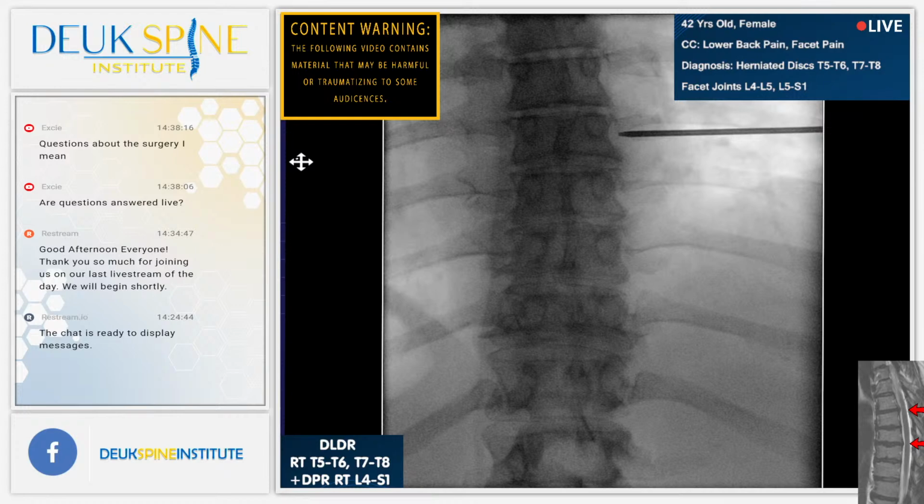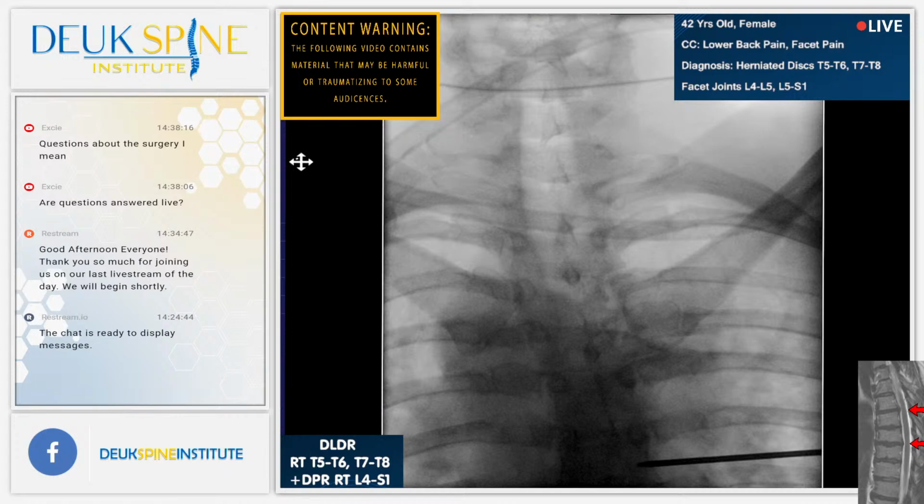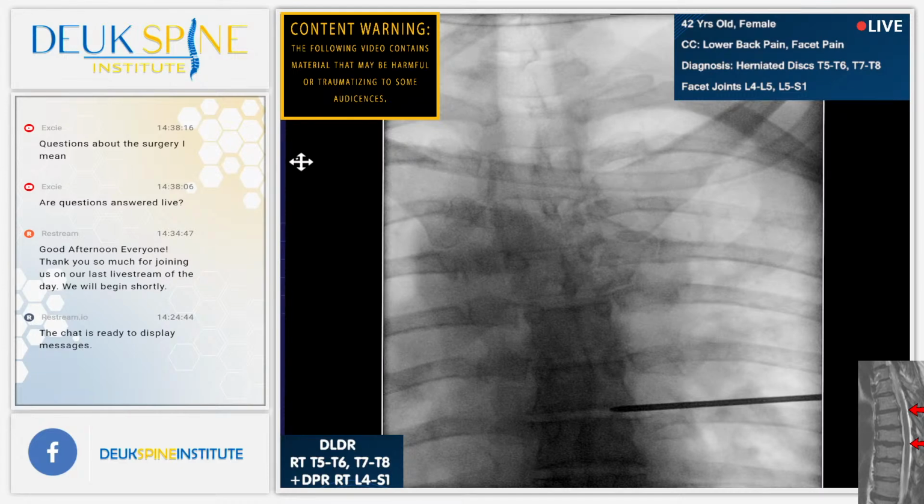And I want to count once again, but this time from the top down. So let's move to the top. I should be at 8. Let's move to the top and let's find the first rib. All right, so there's the first rib. We need to clean that up a little bit. I can see the first rib, and that looks like T1. We need to change the angle of the fluoro a little bit, probably angle it top forward. Yep. That's a little bit better.